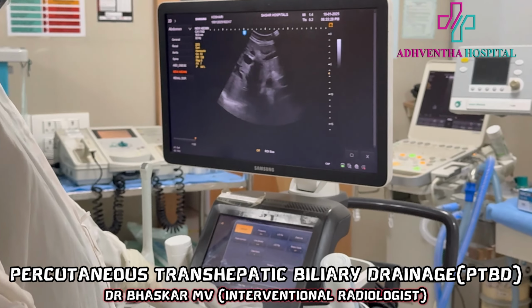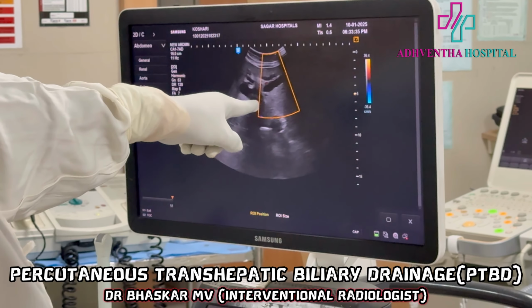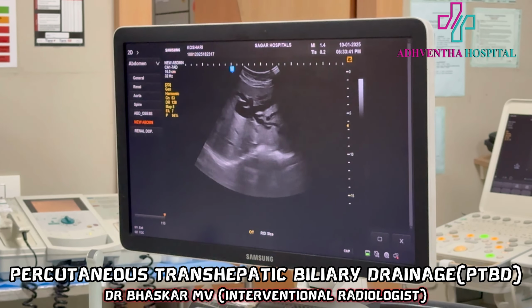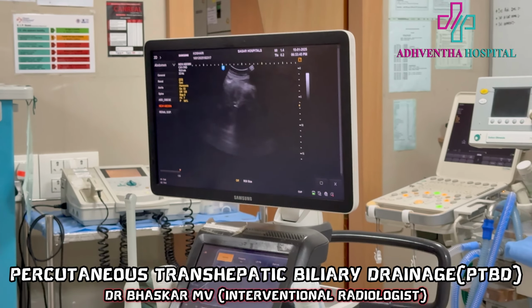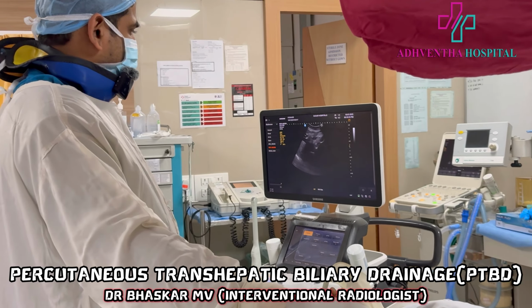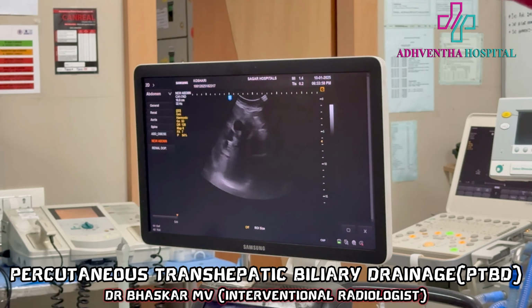Lot of biliary radicals dilatation, gross. And you can see here, this is a hepatic artery. And this is a dilated biliary radicals. Whatever black we are seeing, that is all biliary radicals. When we trace the CBD, we are not able to see the common bile duct, and we can appreciate a mass. So that mass is possibly a cholangiocarcinoma, which may be obstructing up to the confluence.